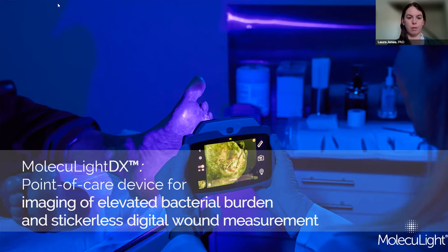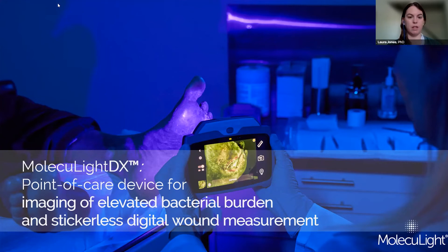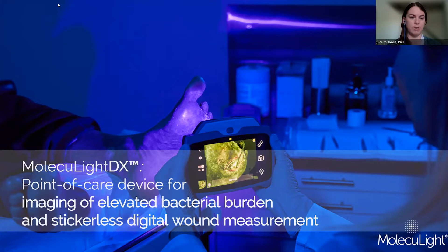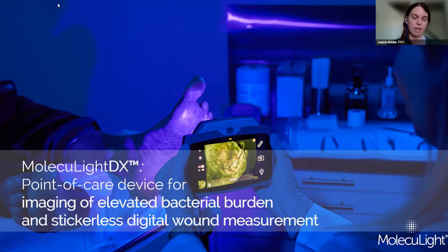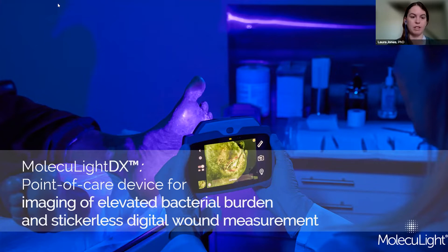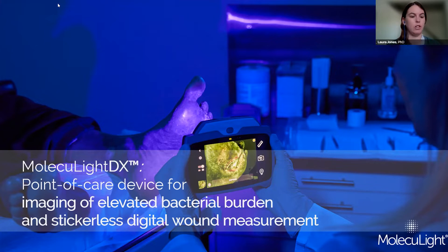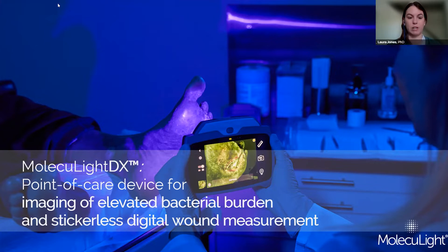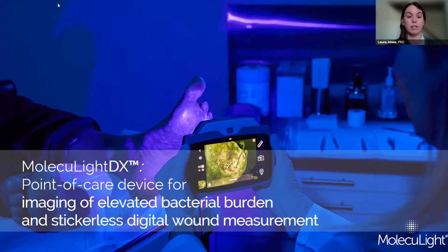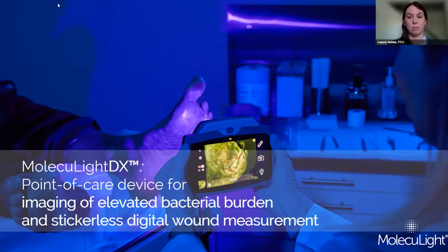Thank you all for joining me here today to talk about the newest Moleculite device, the Moleculite DX. It is a point-of-care device for imaging elevated bacterial loads and also does stickerless digital wound measurement.